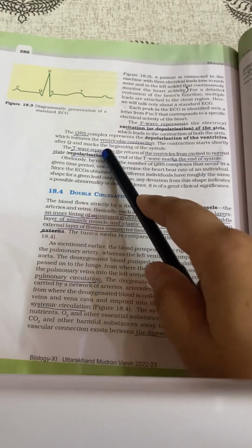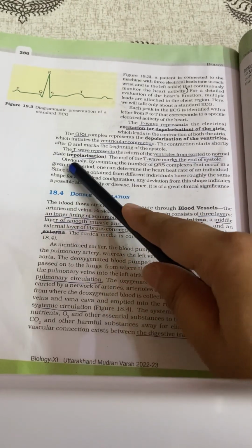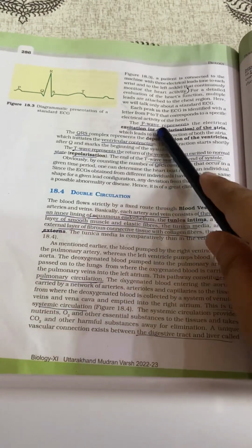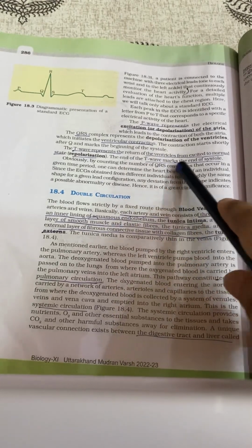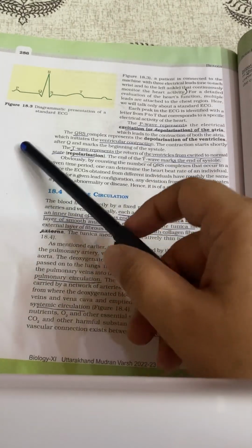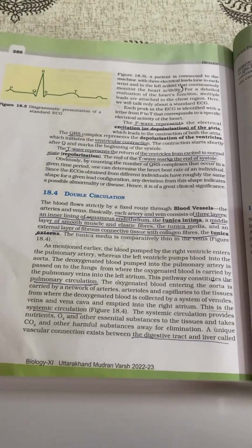That is, the T wave represents the return of the ventricles from the excited to the normal state, that is repolarization. Here depolarization, and here it is repolarization. The end of the T wave marks the end of the systole, यानी कि वो अब relaxed state में आ जाएगा, and then the cycle will go again to this P wave. Right, and there are some few more points.